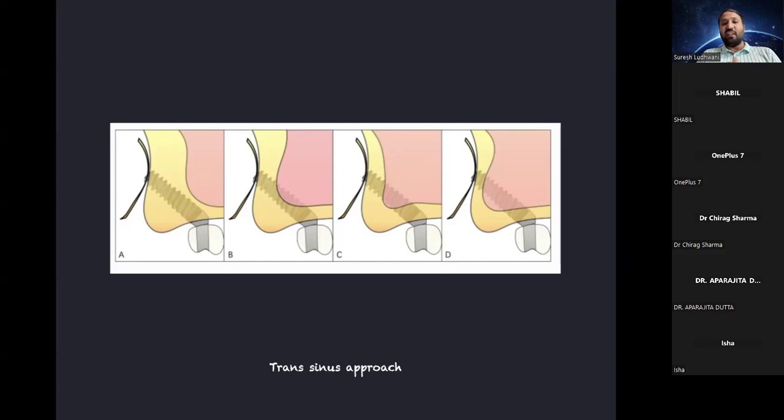Because most of the time when we have explored through surgical guide, we haven't succeeded to engage the trans sinus thing because it's an empty hole in which you are just drilling. You might hit and you might not hit. A, B, you might hit after 15 or 20 trials. So if that is a necessity, then you should.